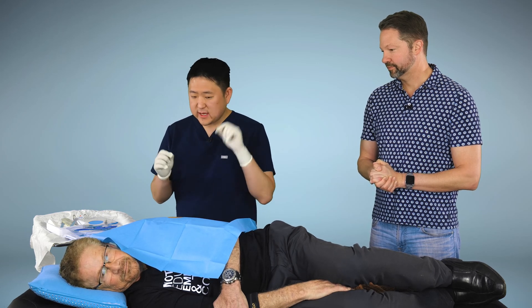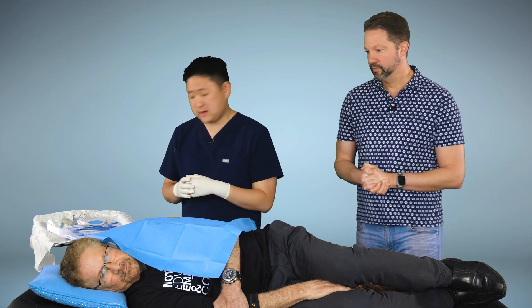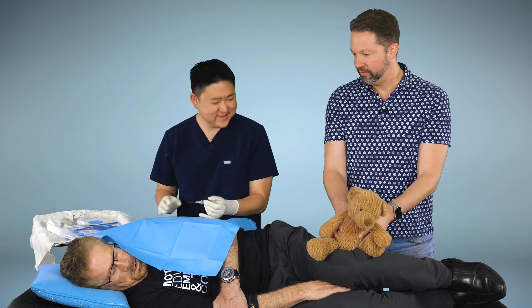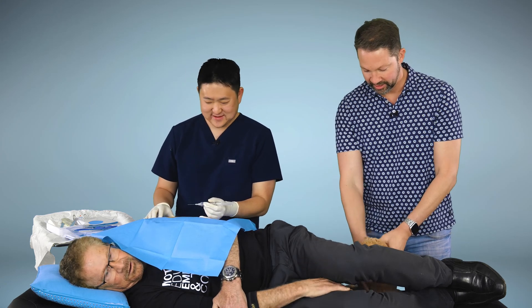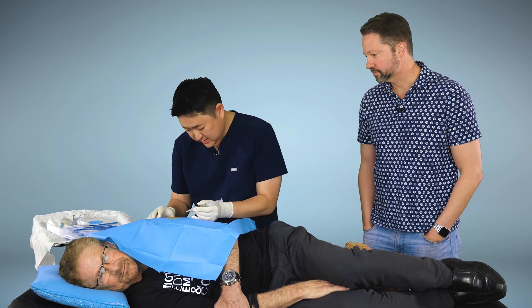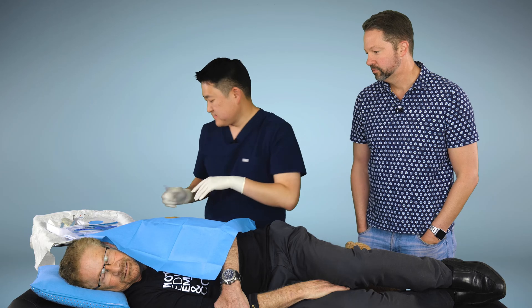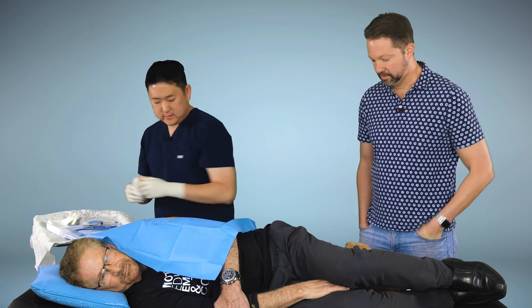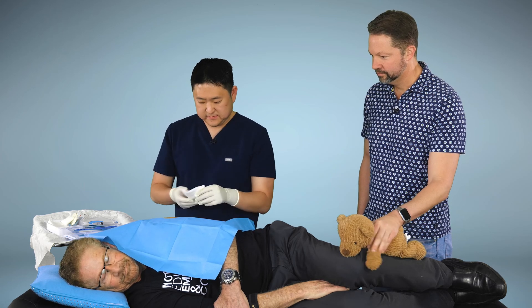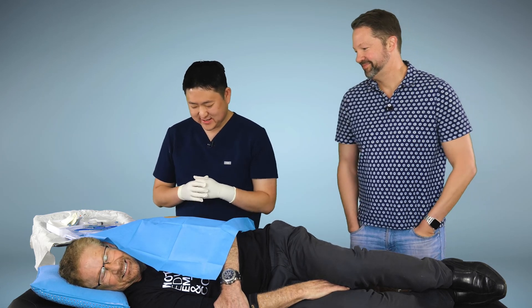The lidocaine is probably the only place where you might feel something. I tell patients it might pinch and burn, but no different than a blood draw or something like that. At Steve's request, I stopped by his house and got Mr. Fuzzleworth, who's going to be here with you for the whole procedure. Okay, so this is the part where you might feel a pinch and a burn as we put in the lidocaine. How are you doing, Steve? Good. We're going to let that area get numbed up for a moment or two.